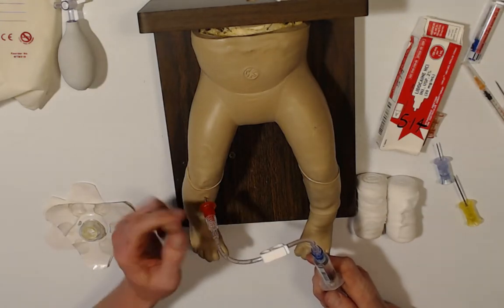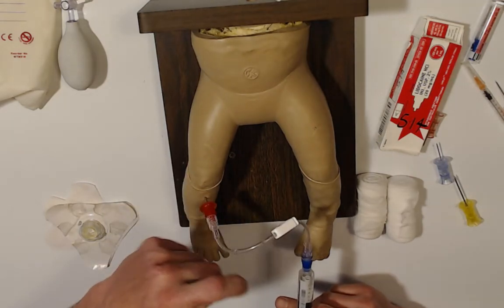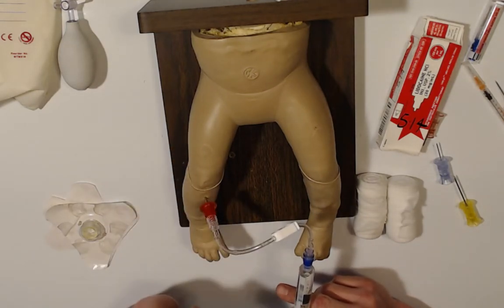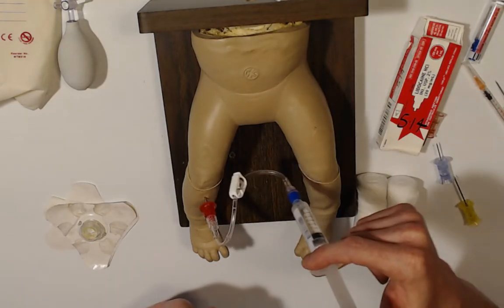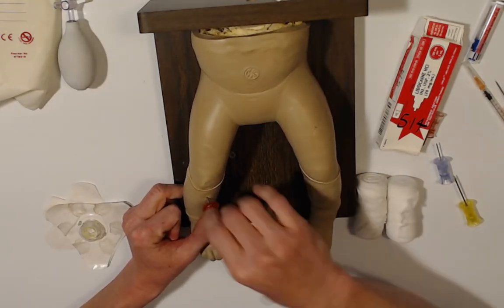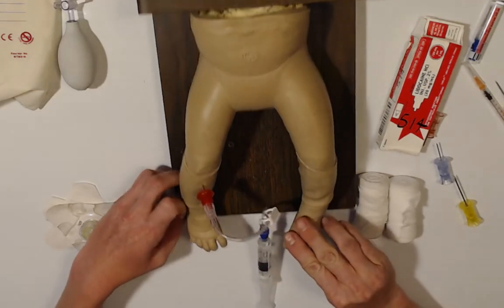Just the presence. And then you want to go ahead and give a little bit of a flush, okay? Don't slam it, because especially with little kids here, we don't want to pop it out of the bone. So nice, gentle flush. It should be nice and easy. If you're really struggling, trying to push hard, then you're probably not in the right place. Also, this IO should be nice and solid. If it's wiggling around, you're probably just scraping the surface of the bone. You're not actually in, okay?